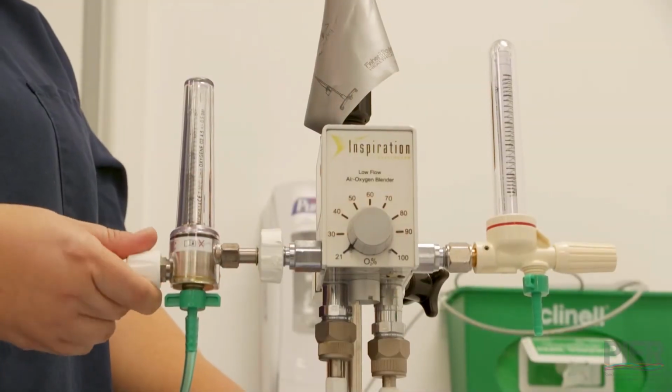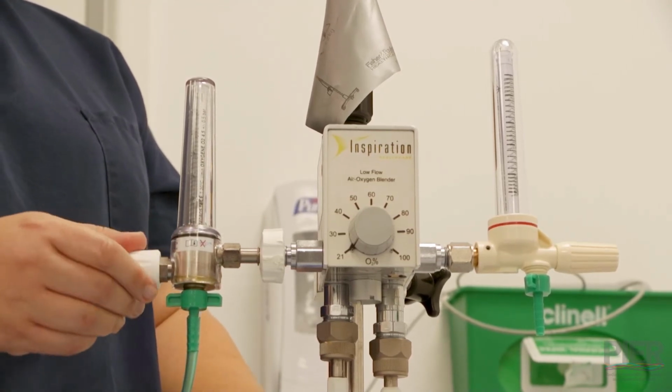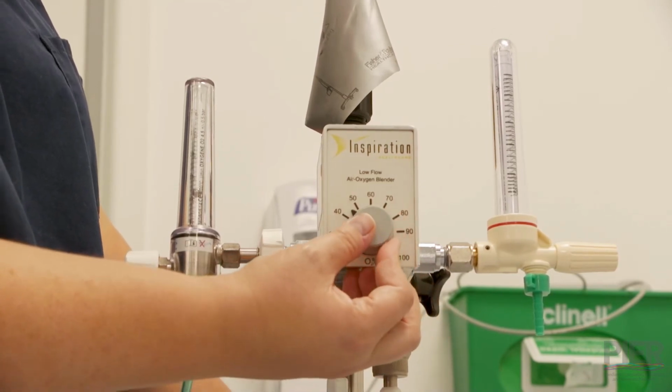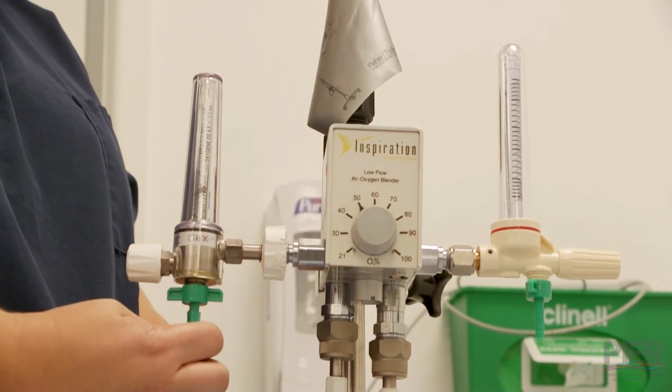We're going to set the flow appropriate to the level decided for your patient, and that is determined by a guideline on the PEER website, and then your oxygen is determined by the dial on the front. Set that again to an appropriate level for the oxygen requirement your patient has.